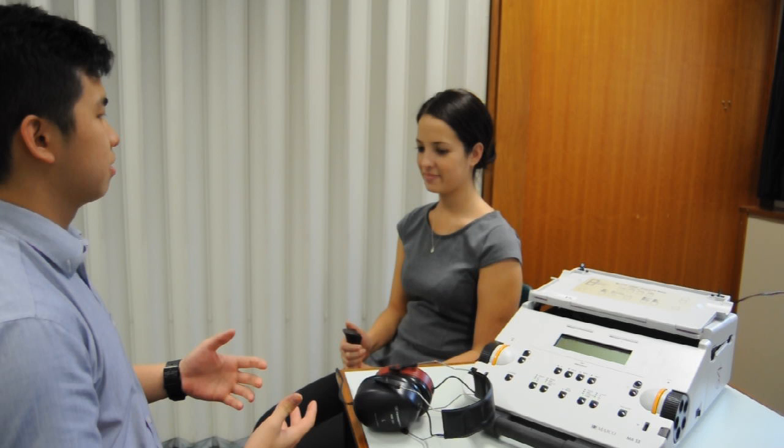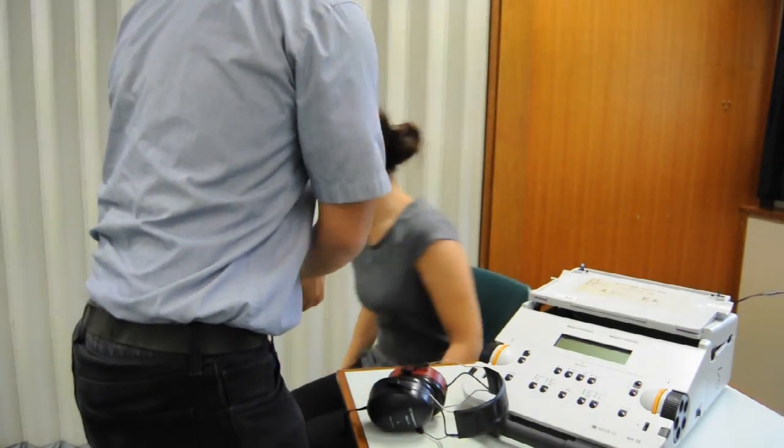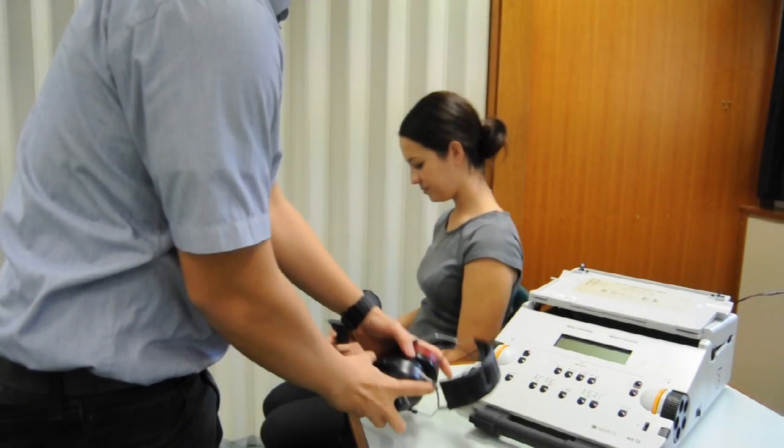Ask the client to remove any items that may interfere with the headphone placement, such as glasses, earrings, and hearing aids. Ensure that the client cannot see you when you are presenting the sounds. Position them away from the line of sight of your equipment and check that they cannot see your hand movements in a reflection.